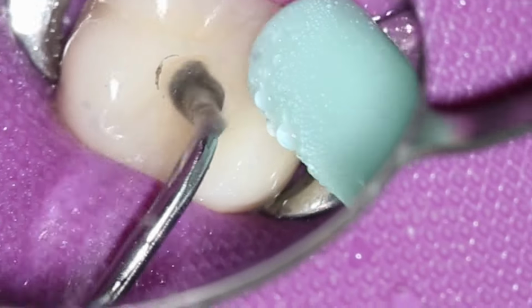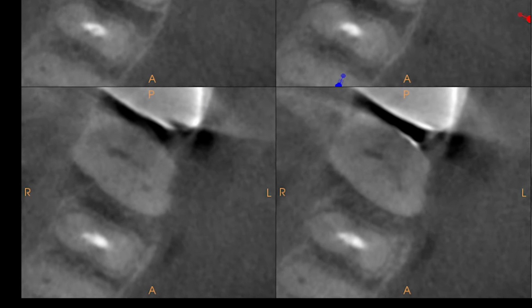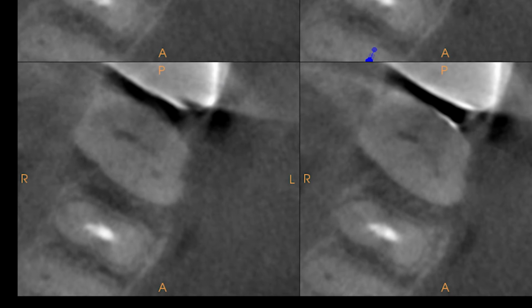So I use the ultrasonic tip, simply trough back and forth, and notice the mirror isn't getting splattered. Joy doesn't have to sit there and keep my mirror clean. And using those landmarks, I find the distal buccal canal, no problem. And I know if I trough along that axis, I will find the palatal canal as well. So I have a road map to find it.